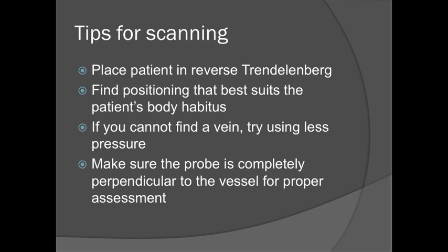And then finally, make sure the probe is completely perpendicular to the vessel for a proper assessment. If you have the probe at some oblique angle, you're not going to get a great representation of what the vessel looks like fully compressed or not compressed at that particular point. So you need to make sure it's completely transverse to the point you're looking at and then apply the pressure.